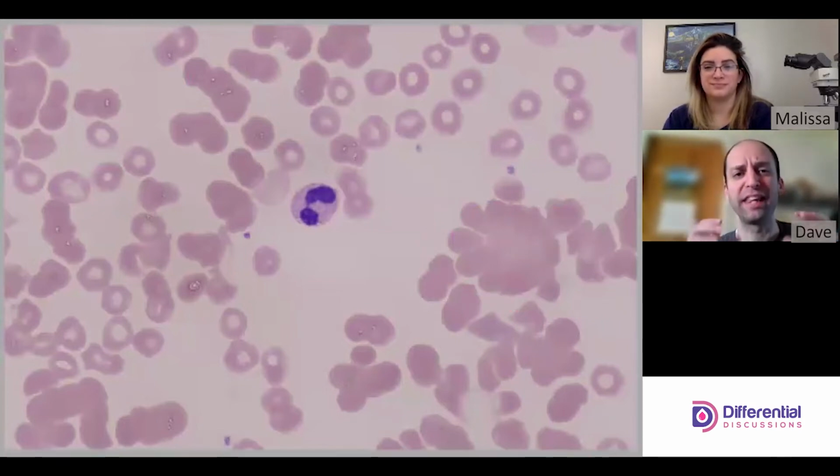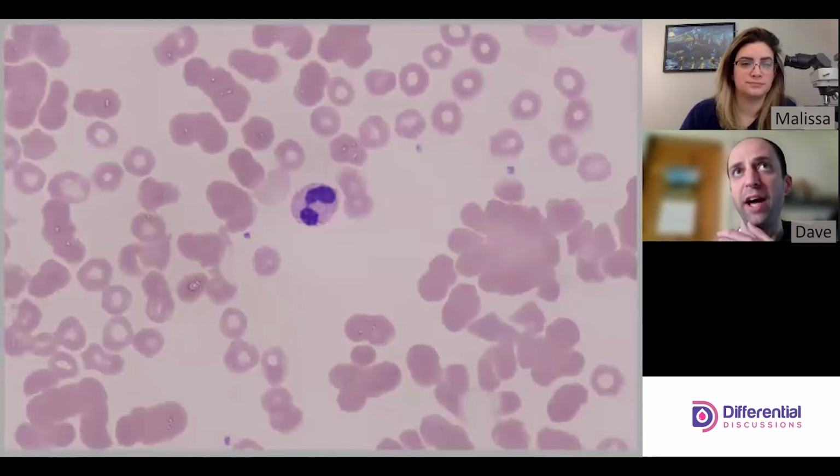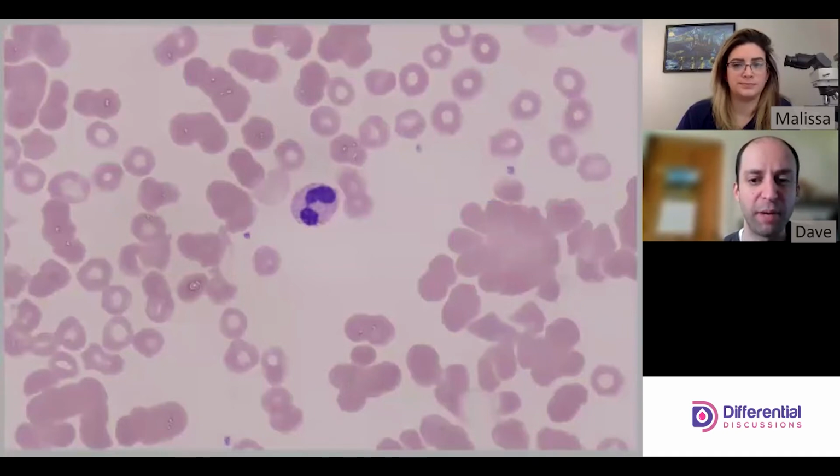That's where you get the false decrease in the red cell count and the false increase in MCV. This affects anything calculated off of these values, because some of the indices are mathematically derived. I'm looking at MCH, so that will be altered. It's of consequence to many of the red cell parameters.